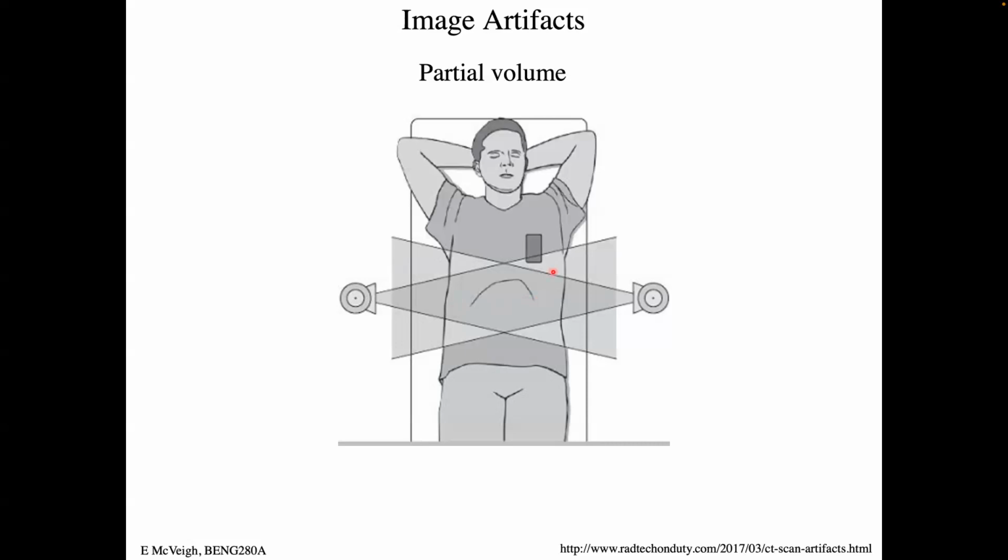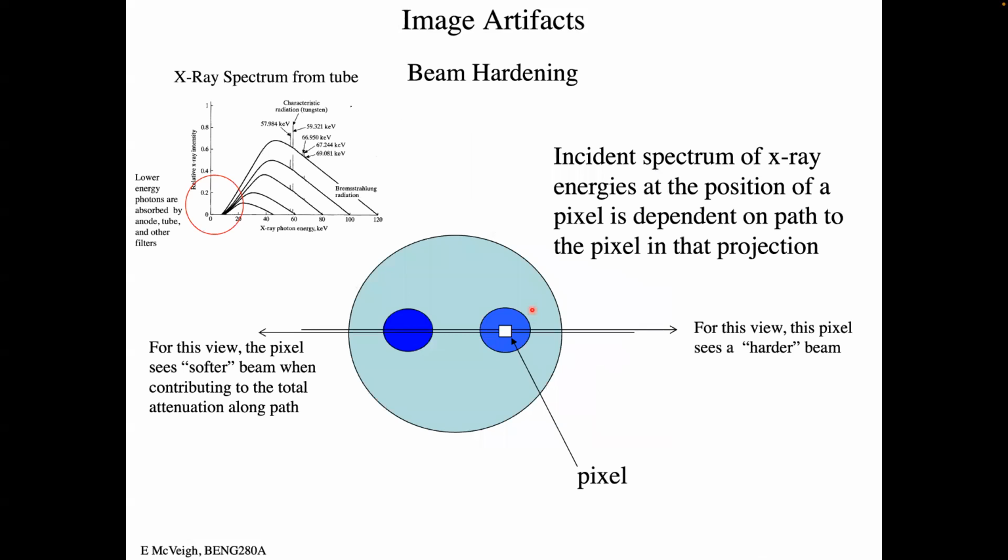And so the result of that is that the field of view you can image with CT in the Z direction actually looks kind of like a football, right? In that it pinches down, right? You can only produce images of things that you've got a full set of projections from. So that's partial volume artifact in Z from these thick detector scanners, right?